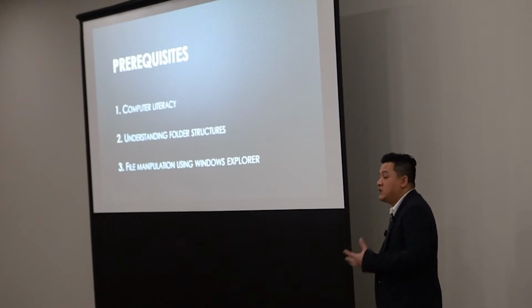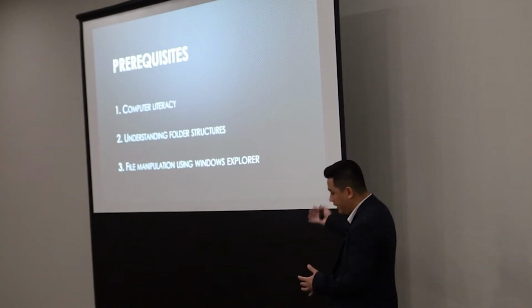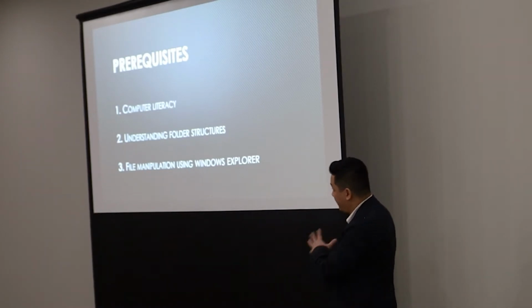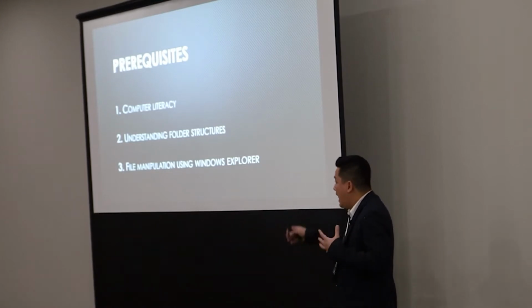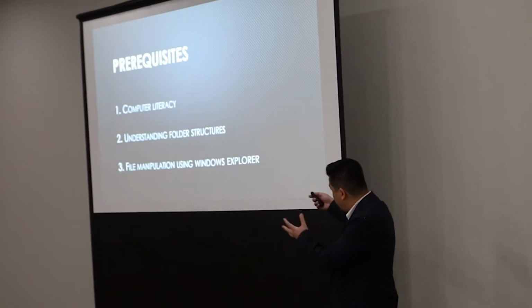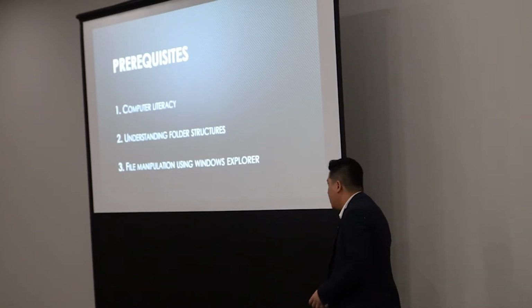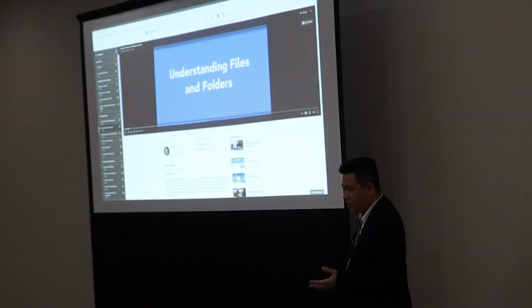So of course some prerequisite understanding that you want to take when working with complex workflows with 3shape. You want to have at least some basic level of computer literacy, understanding the file system, how to move folders and structures and renaming things, and just a general idea of how a computer works. And if you don't know how to do this, I recommend at least taking some kind of computer literacy course online. You can find them online.